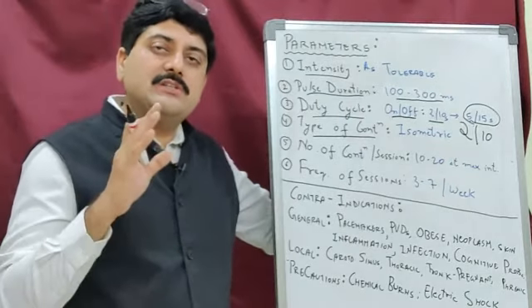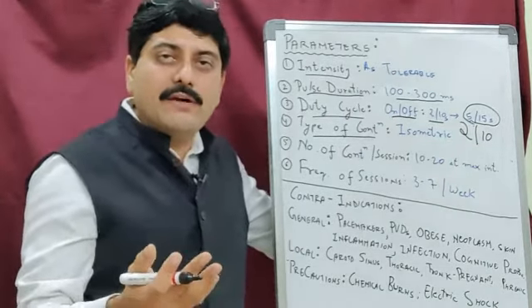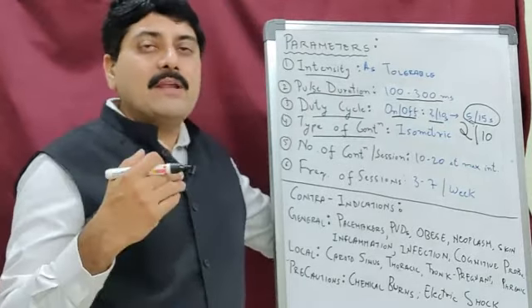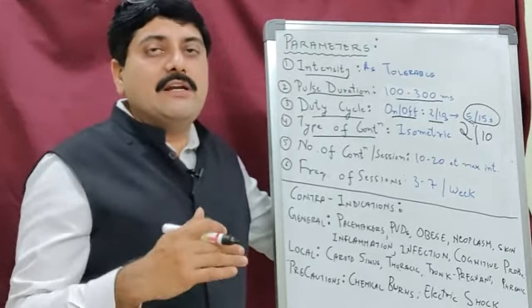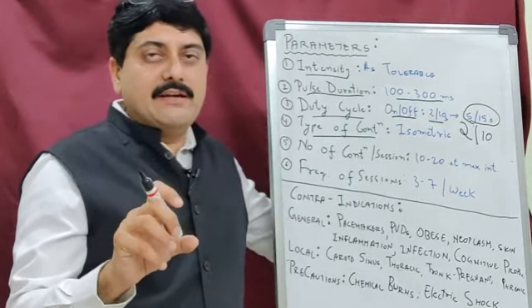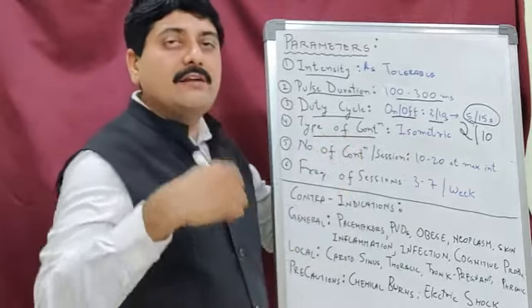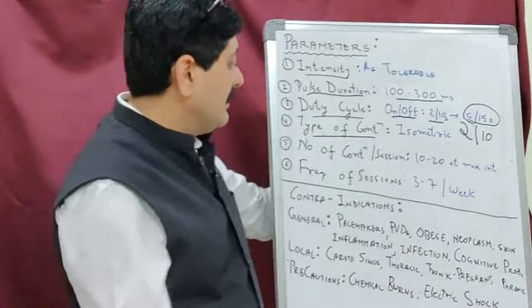Some patients can be fearful, some can have a phobia of current, some can be afraid of the current, and some patients will tell you to go for full intensities. So it depends on you to measure the type of contraction we are getting, and based on that you decide the type of contraction we are going to elicit from the patient with the use of electrical stimulation.